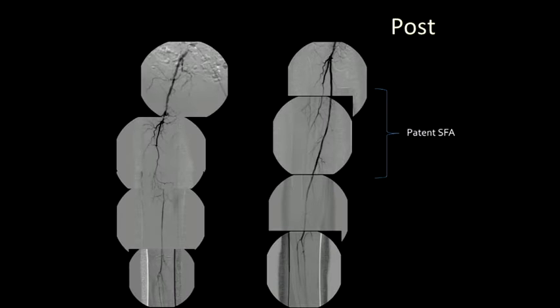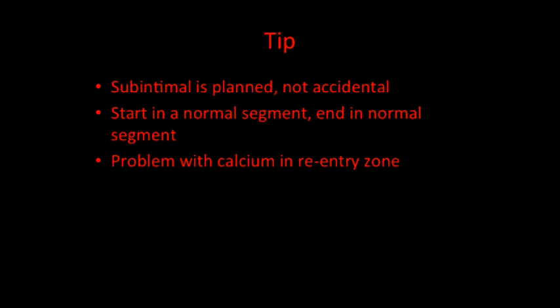In this case, when you do distal access, you require different tools. You have catheters, you're conventional for this purpose. So you have to change the tools you have. Now, different people use different ones. You can use coronary guide wires if you're comfortable with them. You can use the specific peripheral guide wires if you're comfortable with those, basically. The second point is the most important thing. If you're going in for distal access, never ever damage the distal access. If you damage that artery, then surgery is the last resort.